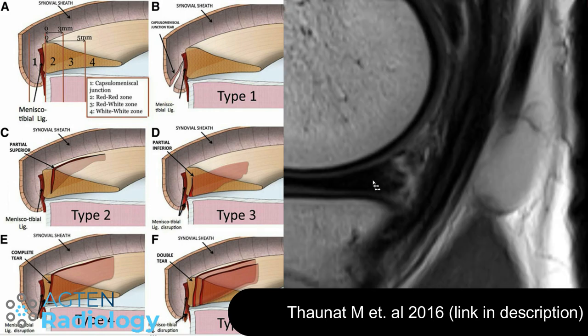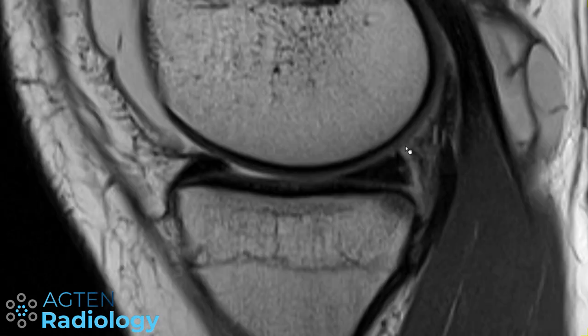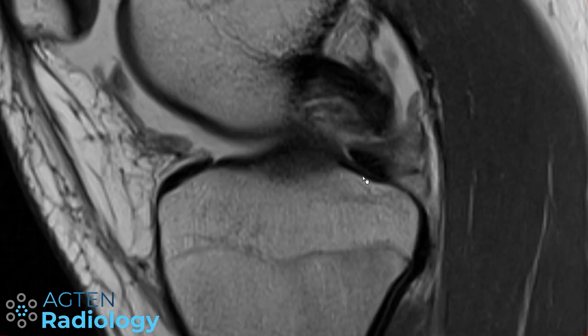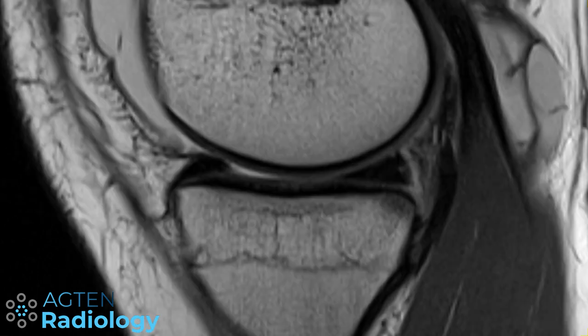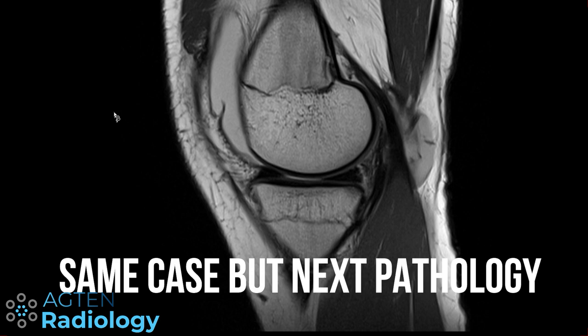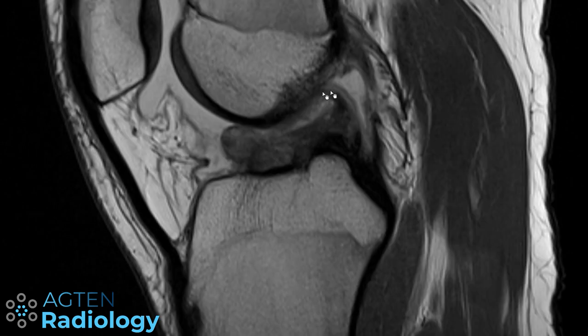Anyways, now let's go back to the case. So basically we have the joint capsule here. The meniscus is detached here from the joint capsule, and the root itself is intact. Now this is a meniscocapsular separation or ramp lesion. And these kind of lesions are frequently associated with ACL tears, and if we go to the central compartment, you can clearly see this ACL tear here.